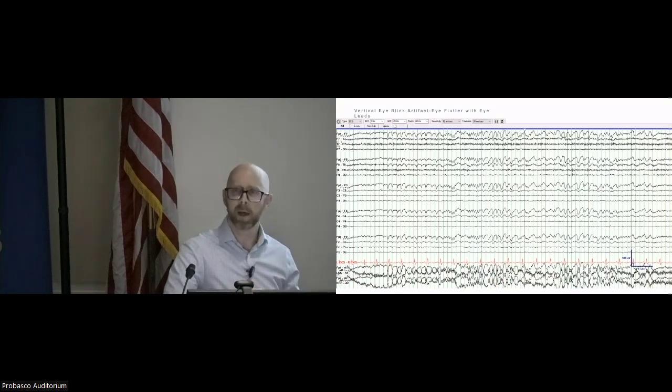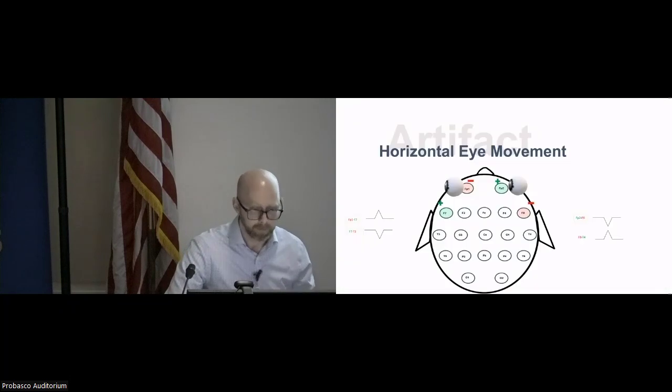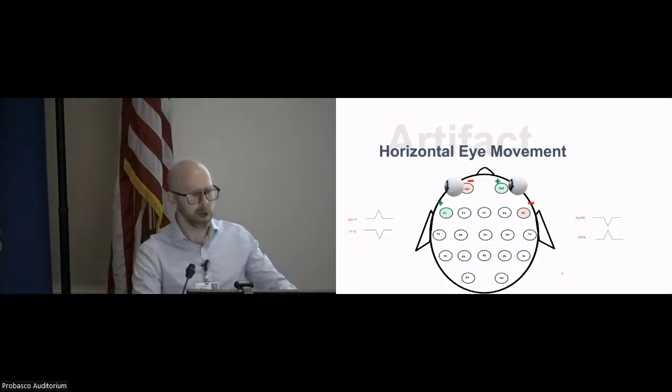Moonzer, did you have that up in Michigan, the eye electrodes? We had that at Mayo. It was super helpful when you're not sure. But in general, you don't need it that high of a percentage of the time, so I'm not sure if it's really worth the extra effort. It's one of those things, when you need it, it's great, but is it worth it? I don't know.